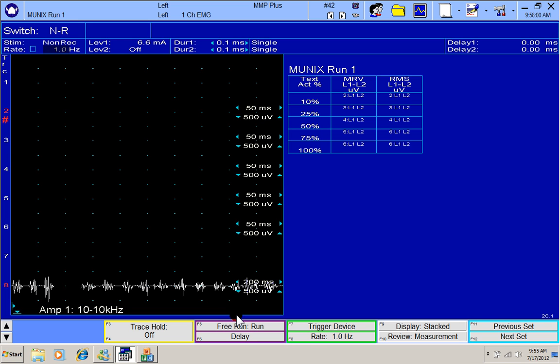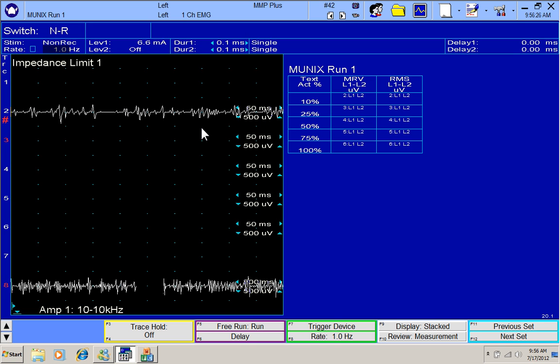What we want is a smooth, steady contraction, and we are going to try 5 different force levels. These are the 5 traces. Notice that we are going to record a sweep of 500 millisecond duration, or 50 milliseconds per division. So this is going to be, let's say, at slight effort, and I like to have an amplitude of about 200 to 300 microvolts. No tremor, no interference. So that's at slight force of contraction.